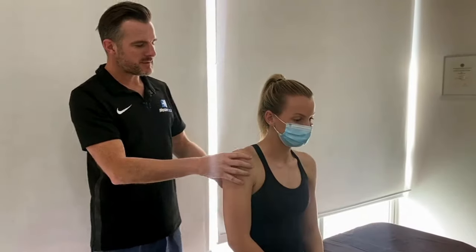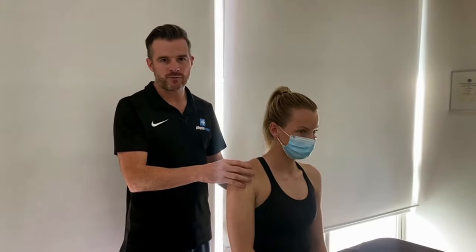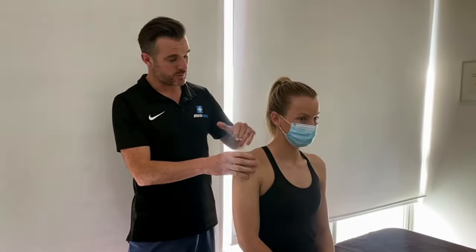If you take the weight off, it's so relieving and it helps settle it down. That person can't hold their shoulder up all the time because it's just impossible, so if I can use tape to do that it'll give them some relief and a better chance for it to settle.